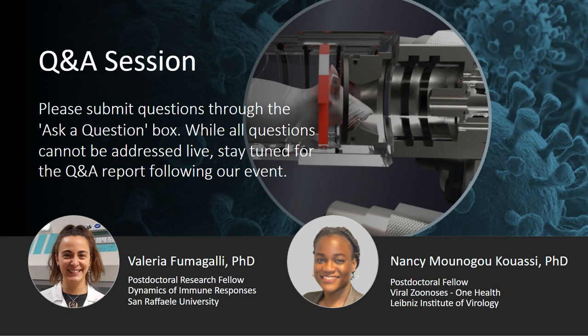The first problem with restraining hamsters is that they don't like it, and they are really stressed. They are bigger than mice, but they're also really stressed. We tried to restrain a hamster, and it didn't go very well. Then we thought, okay, maybe we have to think about other methods. It's possible to measure lung function directly, the endpoint measurement, using tracheotomy. Also, you have to kill the hamster or the mice and then measure the lung function directly.